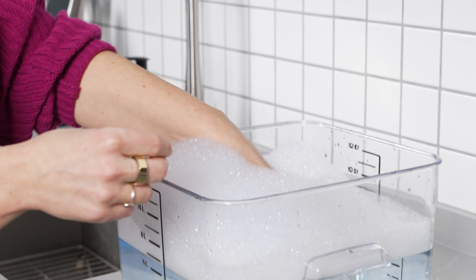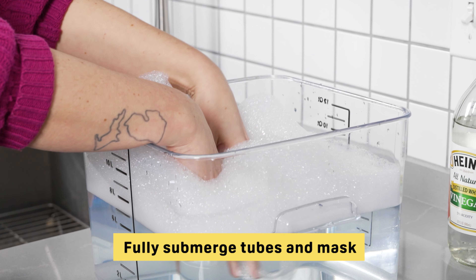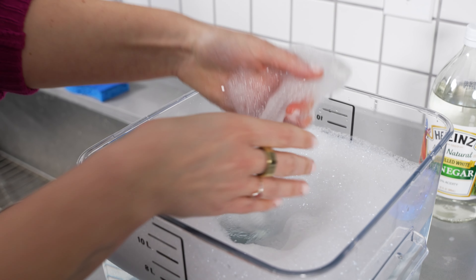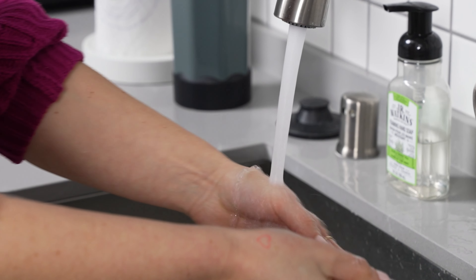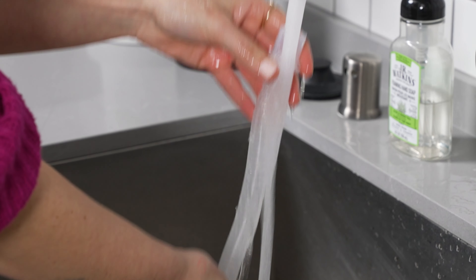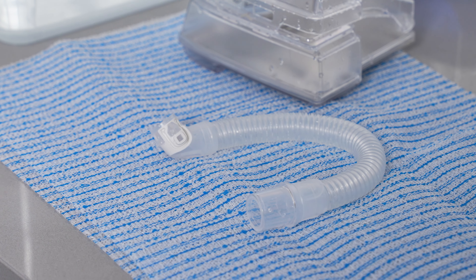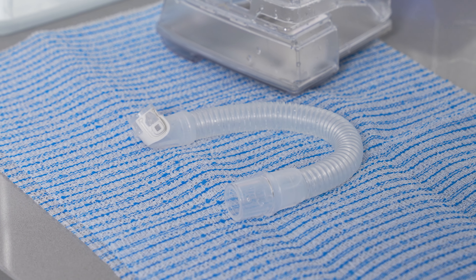First, you'll need to disassemble your CPAP machine before cleaning it. Make sure the device isn't plugged into a wall outlet. If your machine has an integrated battery, be sure to remove that as well. To clean your CPAP machine, you'll need the following: a mild soap that's unscented and isn't made for moisturizing, warm drinking water, a container for soaking your hose such as a tub or large bucket, a clean smooth towel, and if your machine has a humidifier, you'll also need white vinegar.